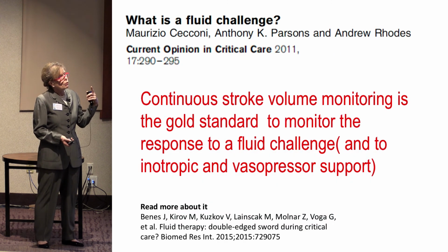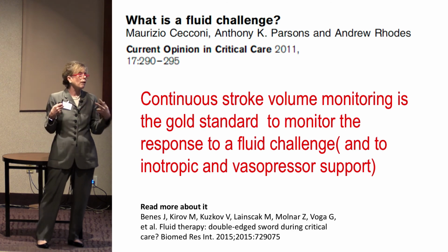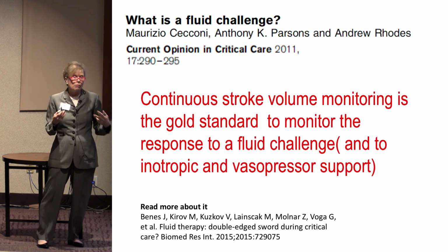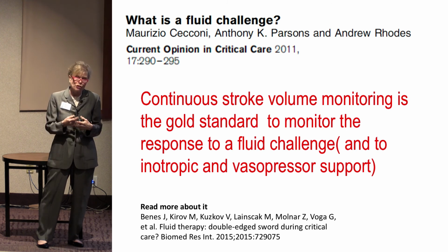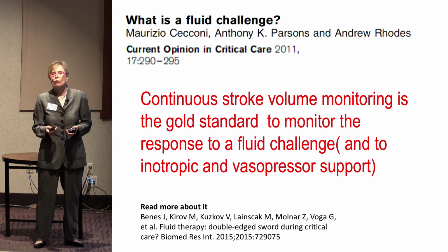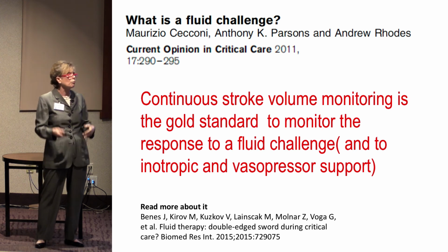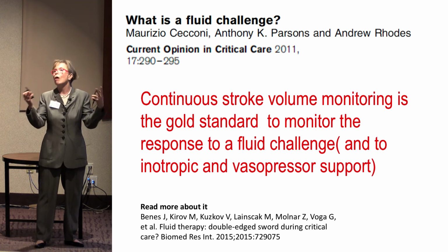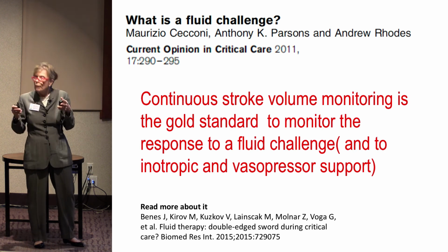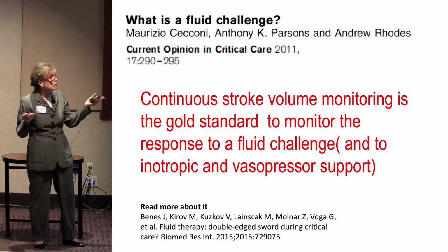So I think anybody who is following the evidence and putting this into play in their own practice, we talk a lot about how we actually measure whether or not a patient is responsive to volume. The overarching evidence would say the only way you know if someone is fluid responsive is if you're actually doing a stroke volume measure. You can't really look at volume responsiveness from arterial pressure or CVP. We already know that. We know that evaluation of fluid responsiveness really does require that we have a methodology for stroke volume monitoring. And continuous stroke volume monitoring is the gold standard today.